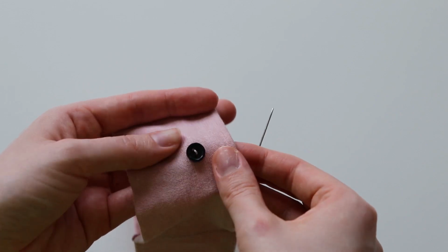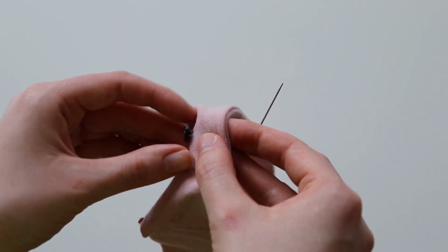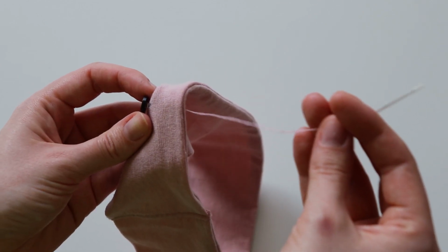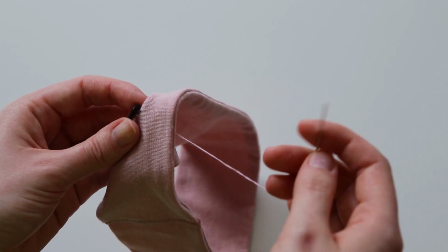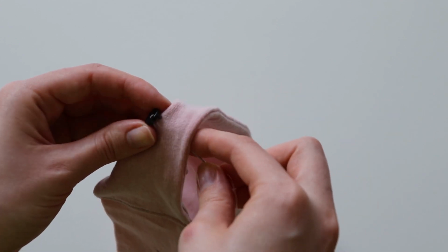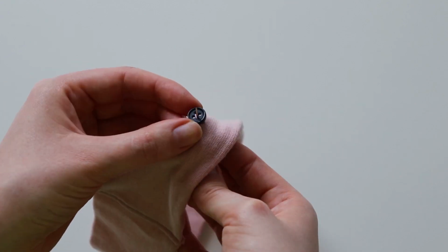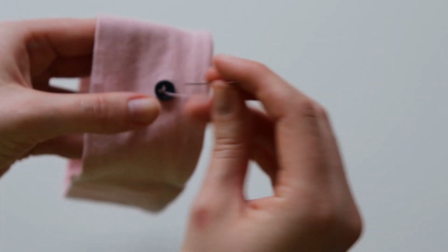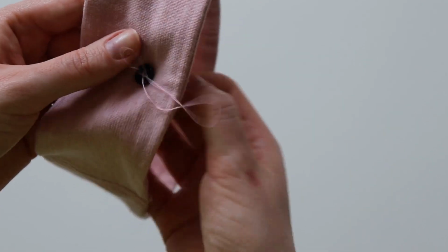Ta-da! When you do this though, you do want to make sure that this is not super tight. You want to leave enough room because the mask is going to be behind here. I do recommend obviously making sure it's secure, but leaving enough room that this could fit behind there. And again, if you had bigger buttons, this would be a little bit more ideal, but we're just using what we have, kids. So what you're going to do now is just continue looping this through all the holes, going back and forth between all of the holes, making a crisscross to really secure this in place.